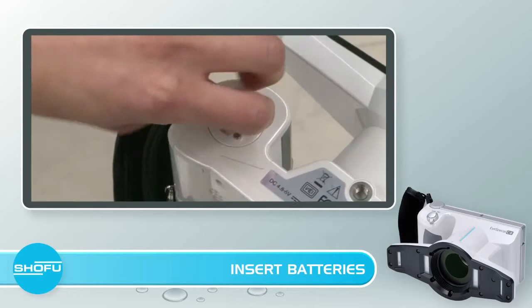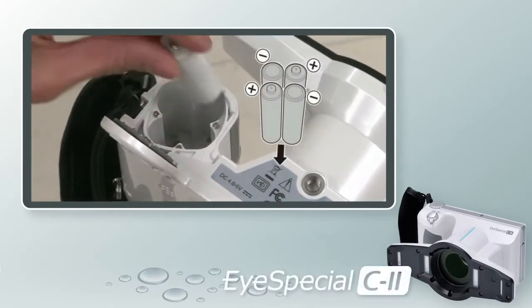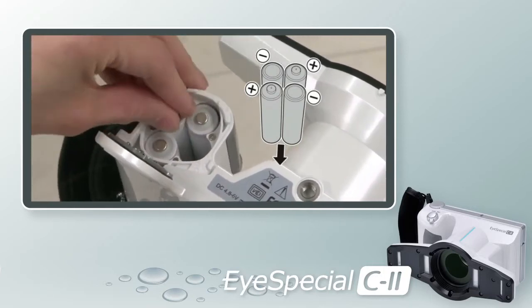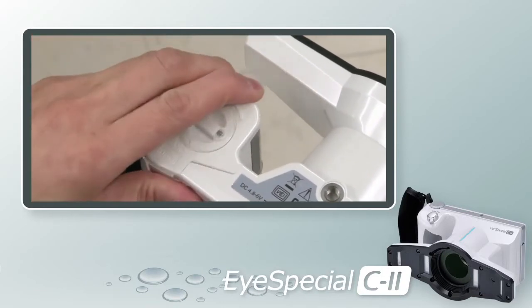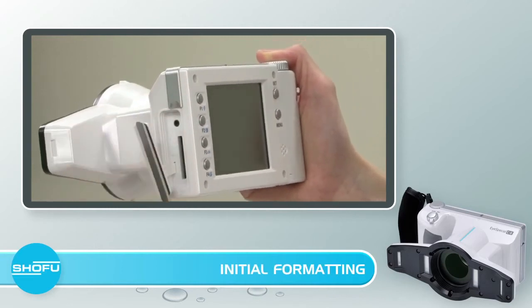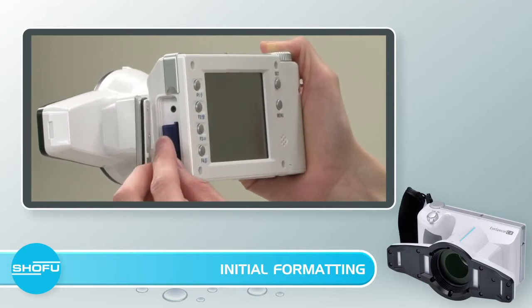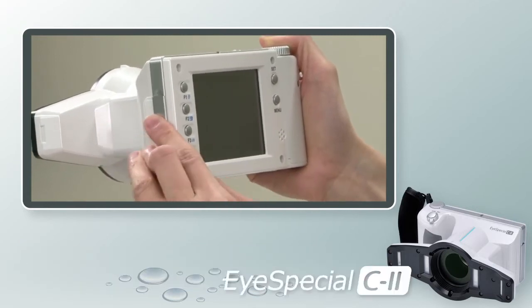The iSpecial C2 comes with four AA batteries. To insert the batteries, flip the camera over, turn the dial to the unlock position, and slide the door forward to flip it open. You will then see a diagram next to each battery slot for how each battery should be placed. Next, install the SD card into the camera — pull open the SD card slot tab, insert it gently with the back of the SD card facing you, and push the tab back into place. You are now ready to turn on the camera.